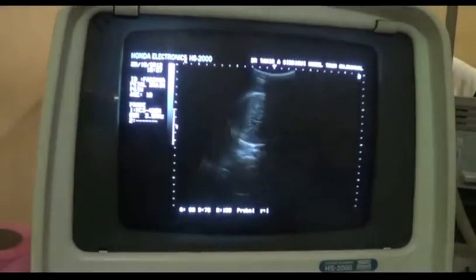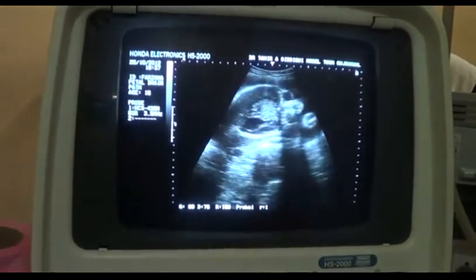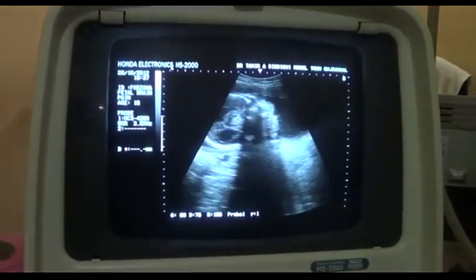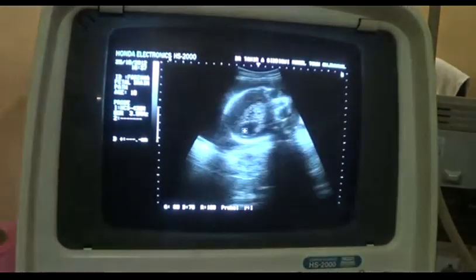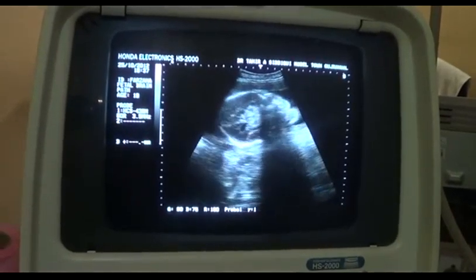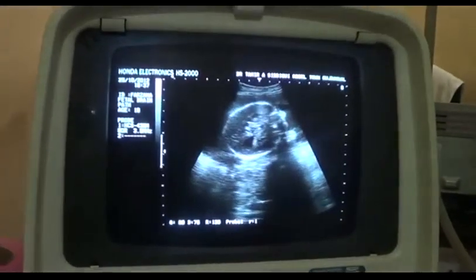Now you see that I can see the head just below the epigastric region, where I am having an impression that there is something wrong in the fetal brain. I will share with you here. This is something, the cystic area. What is this? So let's follow it.